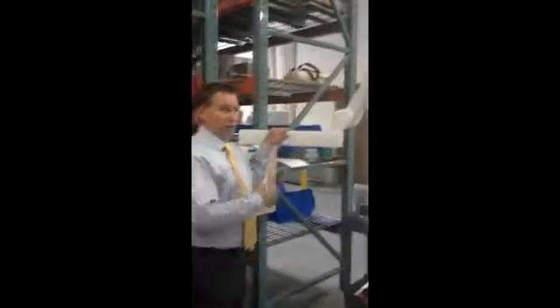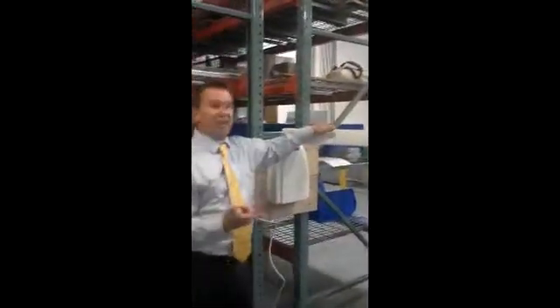The arm lengths we have available are 60 inches, 65 inches, 70 inches, 75 inches, and 80 inches.